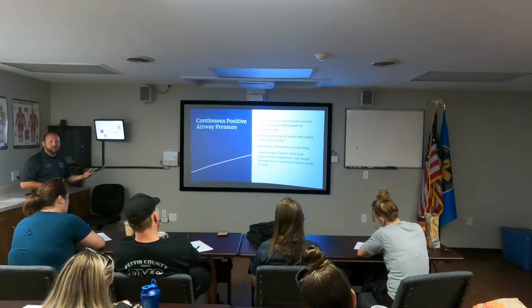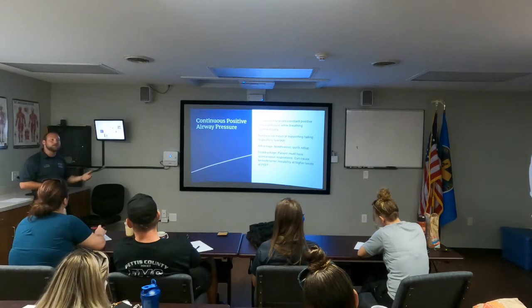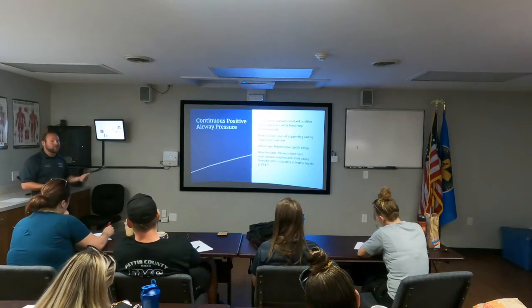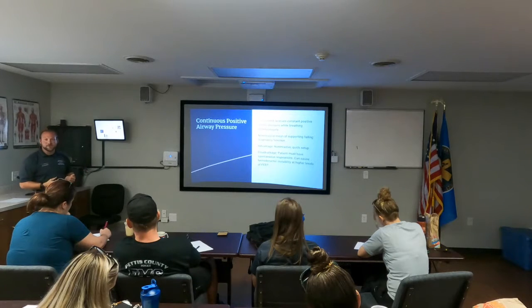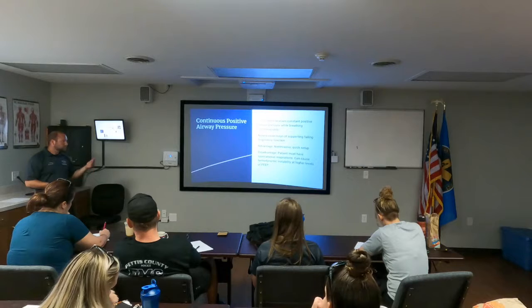It's a pretty quick setup. We have the rescue CPAPs that we have. You basically slap that mask on and set your PEEP. Same thing with the vent, it's not very much different. You have it set for a CPAP mode, you set your PEEP, and you go from there.